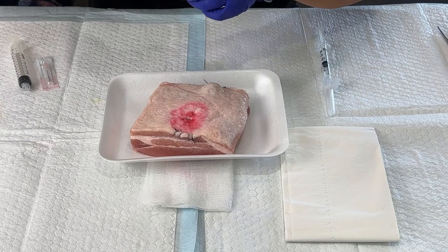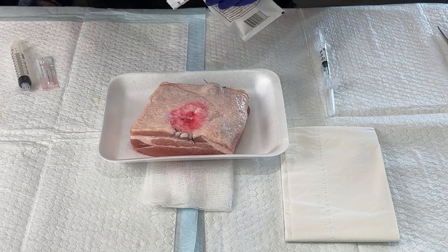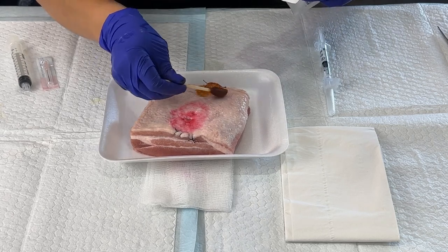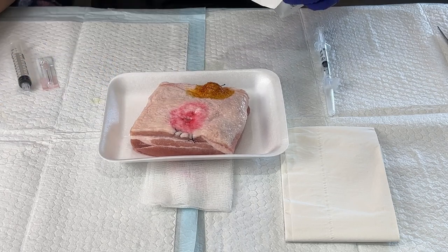The first thing I'm going to do is cleanse the wound. I'm going to open up my iodine sticks. Make sure to ask your patient if they are allergic before you use iodine. I'm going to start from the center and kind of work my way out and discard.